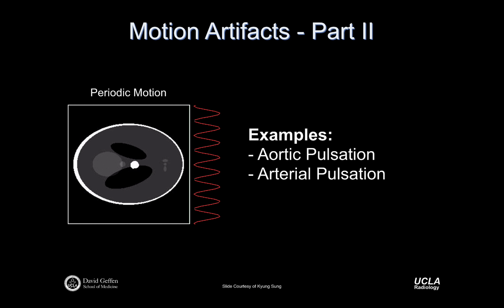And so then it begins to see some RF pulses, and consequently it's quite bright because it's only seen a couple of RF pulses. All of the other tissues in that slice, the chest wall, the muscles, the organs, have seen dozens, hundreds of RF pulses. And so they end up with a slightly attenuated signal because of what we call steady state effects. So new spins, or inflowing spins, tend to be quite bright. Stationary spins within a slice have a steady state signal that ends up being lower than the total available amount of magnetization. And so now we have an interesting situation.